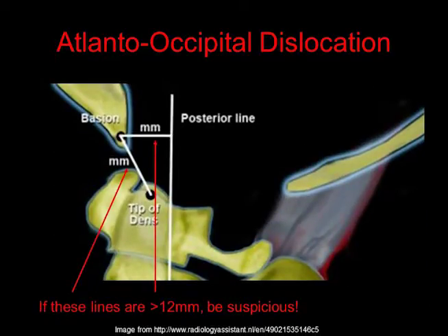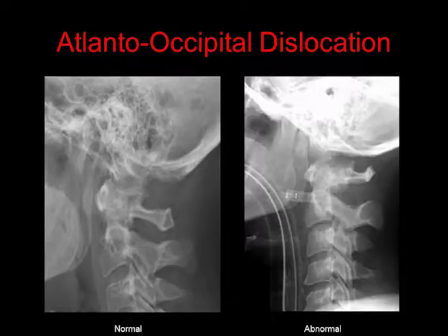If the posterior axial line and the basion-dental interval are greater than 12 mm, be suspicious. Here's an example of a patient with atlanto-occipital dissociation. On the left, the C1-C2 relationship is normal. On the right, we can see that the entire head is dislocated anteriorly in relation to the C1-C2 vertebral bodies. The posterior axial line and basion-axial intervals are increased in this case.